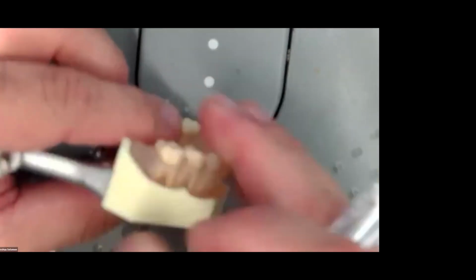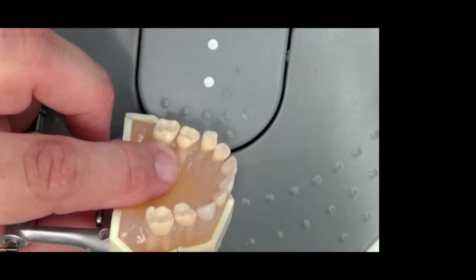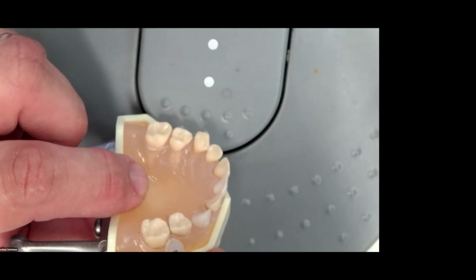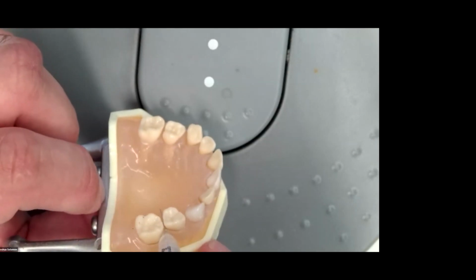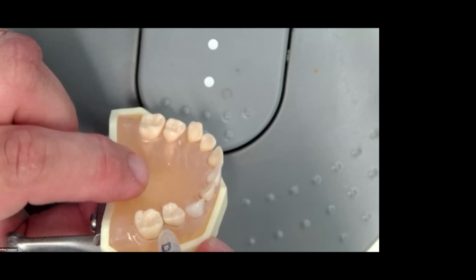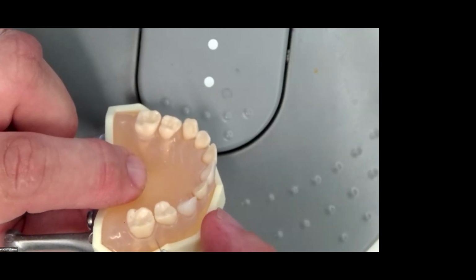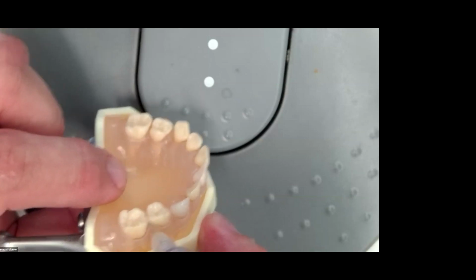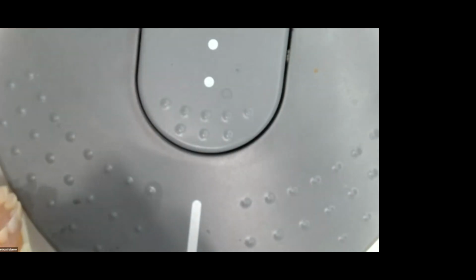It could be that they gave their injection too horizontal and they passed through the papilla. The easy way to tell is if you have immediate blanching on the contralateral side, you're not in the bone. The other thing is that they may have been injecting into an area where there's not organized bone.